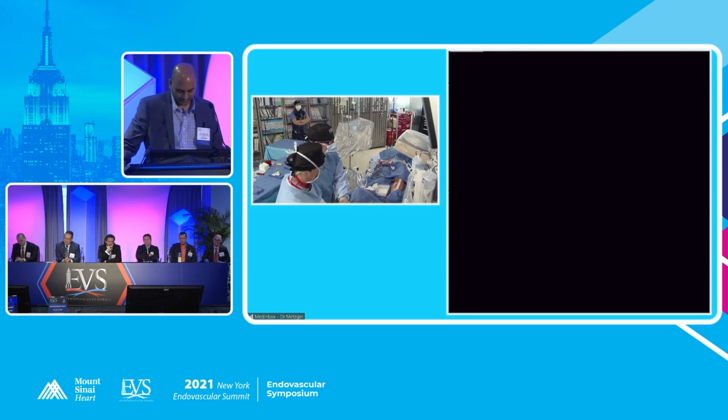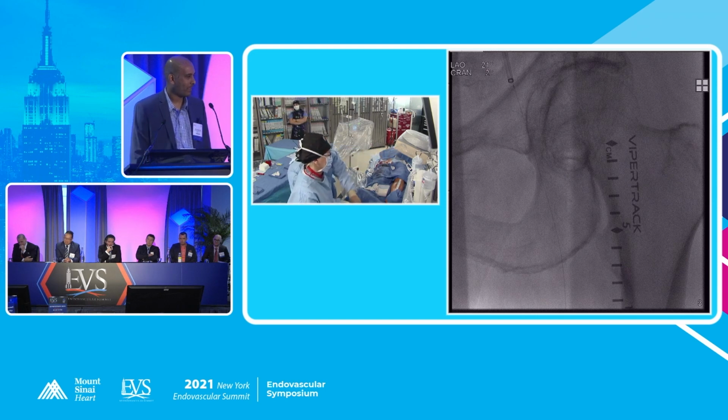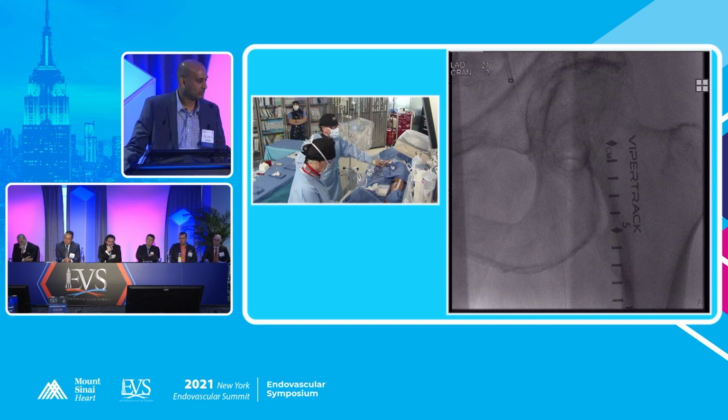We have 5 vascular surgeons in our group, and I get along with them. So I want you to slowly back it up, keep that wire in the foot until we see the balloon or common femoral. We did discuss it with him, and listen, I just did a debate in Viva last week with Jason Lee. It was actually a lot of fun.